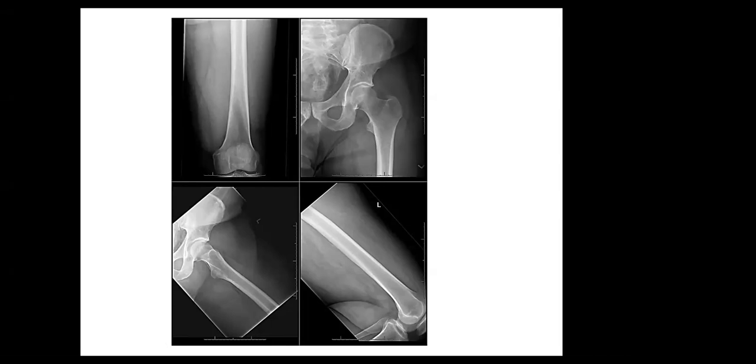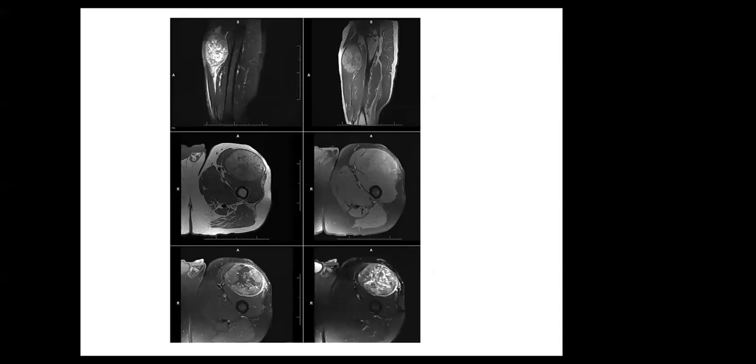I don't know. Okay, so when we looked at the MRI scan, you did really well. You described it, and you said soft tissue sarcoma.